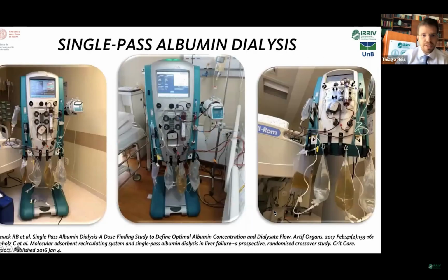Another treatment is SPAD, which stands for single pass albumin dialysis. In this case, it's a normal CRRT machine, normal CRRT treatment. However, here where I'm pointing down in the green scale, we have a solution of 3% albumin instead of a normal dialysate.